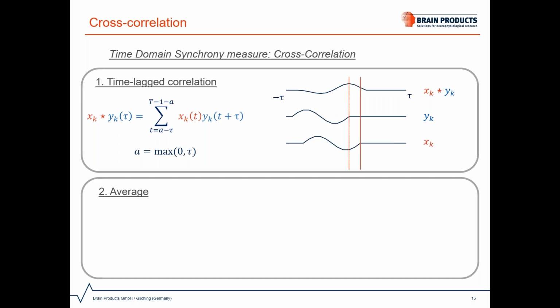Only if we shift the signal further, more negative values are matched with positive values and they make a negative product and the sum will decrease until it reaches a minimum at the antiphase, where all negative values are matched with all positive values. If all time lags are taken into this function, we receive a typical cross-correlation function having a central peak and two recurring side lobes.